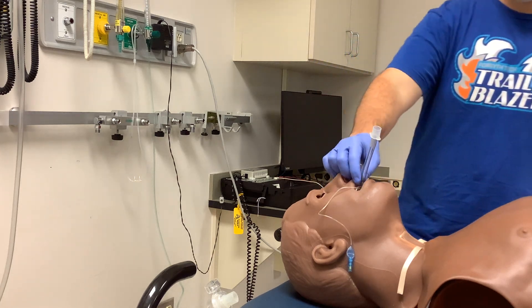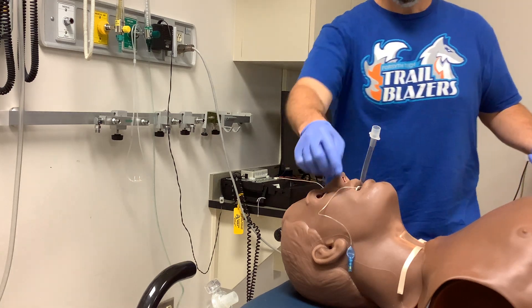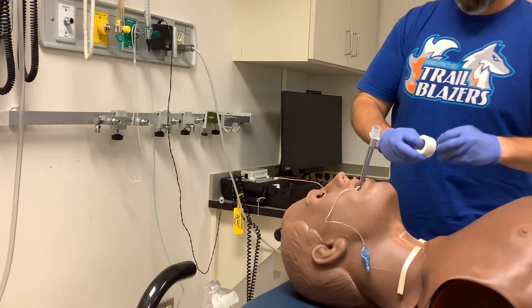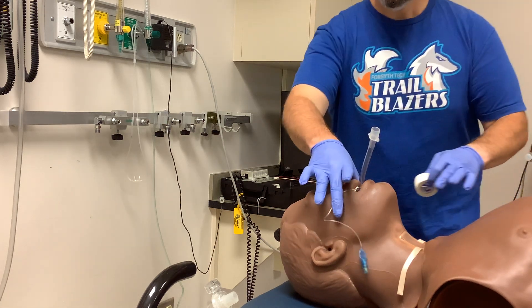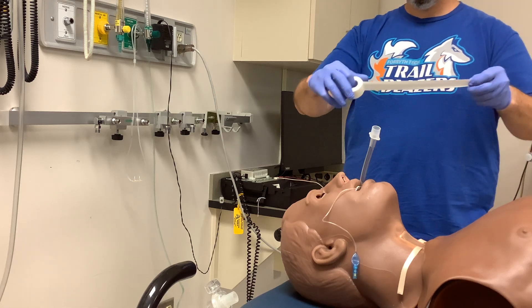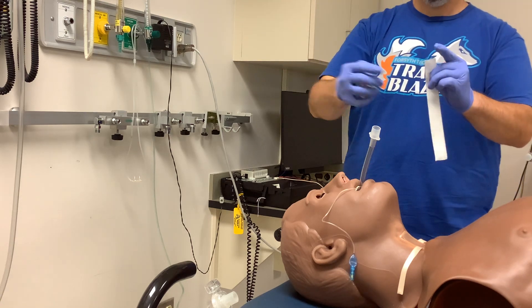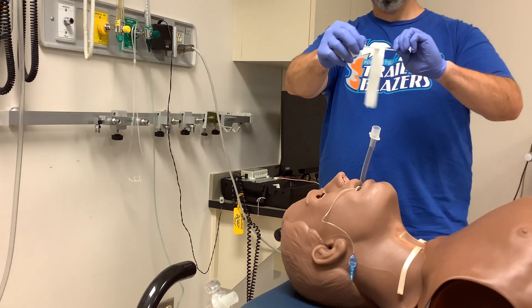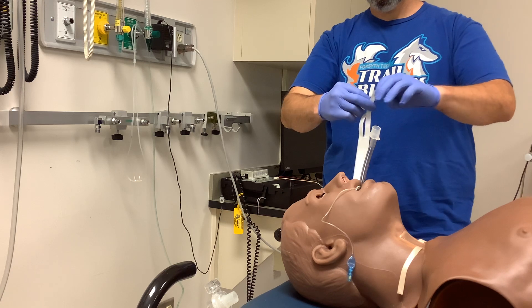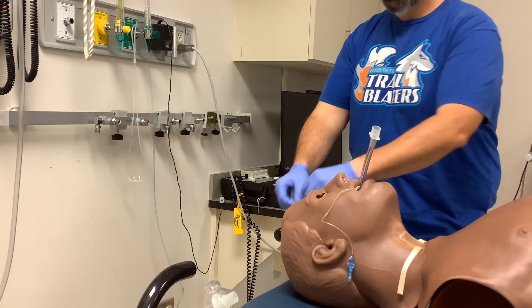So you're going to make sure that you hold on to it. This is a mannequin, so it's not going anywhere, but I do want to go over how to appropriately tape the tracheal tube. Typically what you'll do if you're going to tape to the cheek: grab your endotracheal tube tape, pull what looks like would go across the face once and rip that. Now that you've got that ripped, you'll take and split that down the middle about halfway down and then flag those, fold them over so that it doesn't stick to itself, and then you can set those aside.